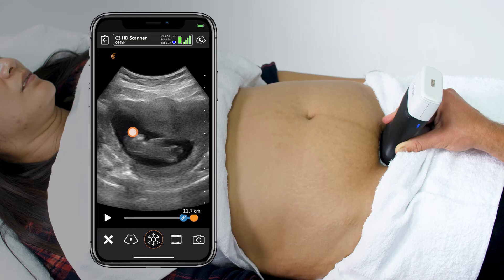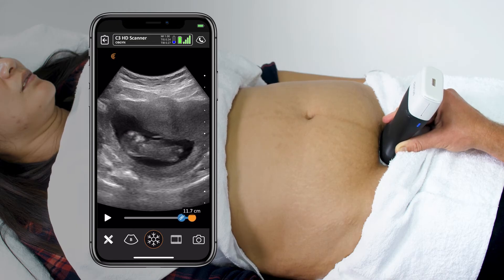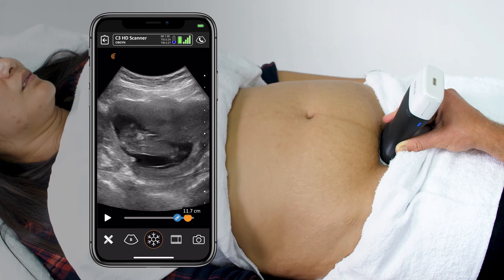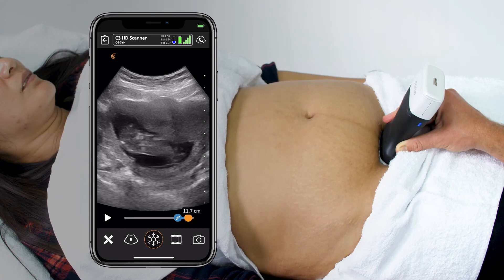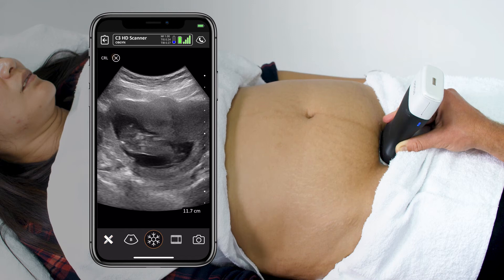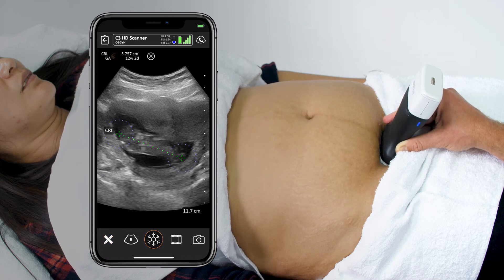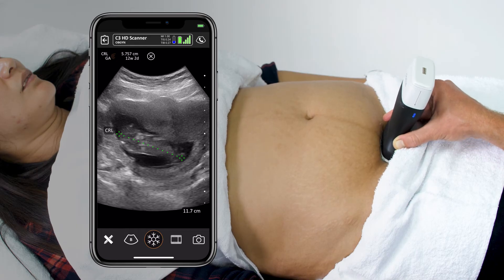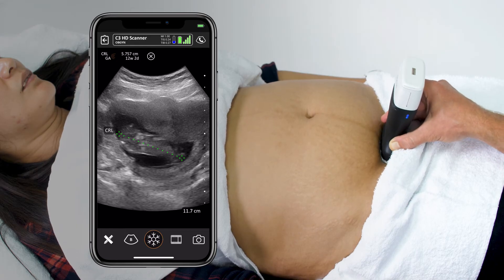Once I have it, I'll quickly freeze the scan, sometimes cineating back to find that best image, then put on the calipers for CRL and measure one pixel at the top and one pixel at the bottom to get my estimated gestational age — in this case, 12 weeks and two days.